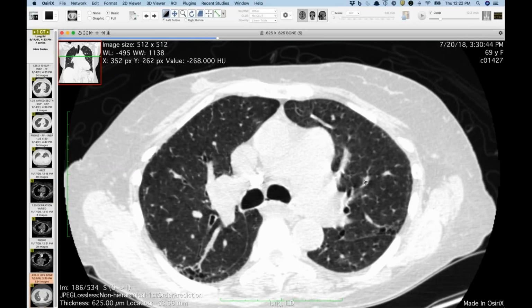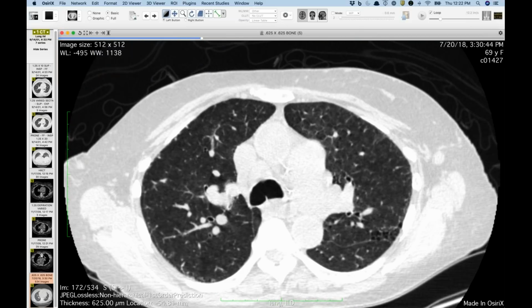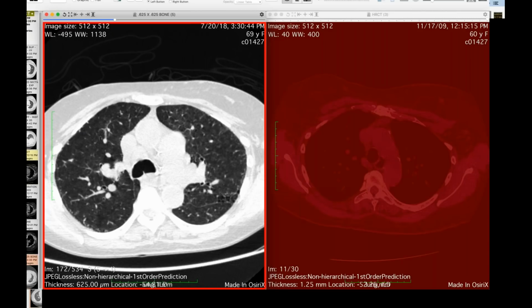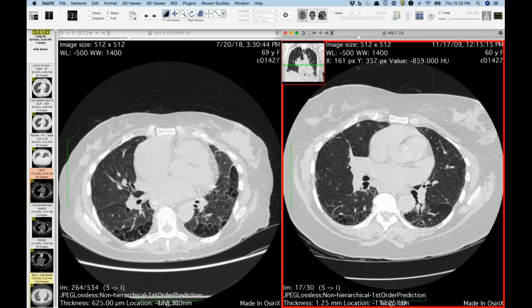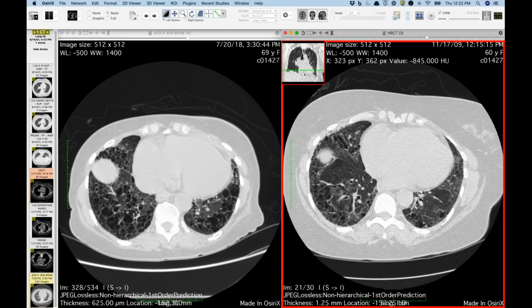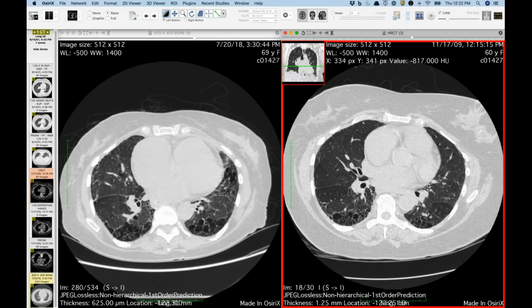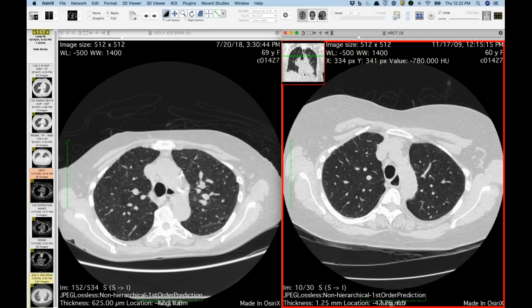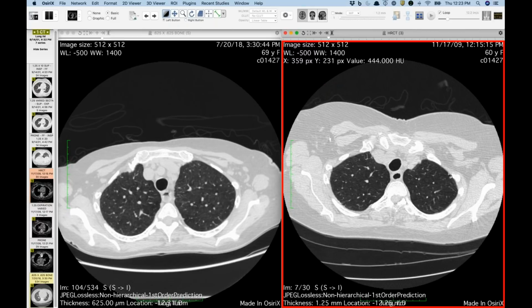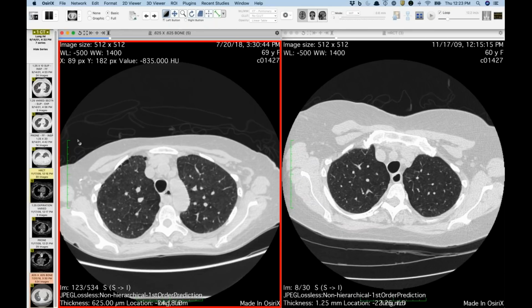This is a pattern that we've seen numerous times in connective tissue disease patients, and this patient had a history of mixed connective tissue disease. This is a nice one because I have almost 20 years of temporal evolution of these findings. They haven't been on treatment since 2009, and in 2009 there's a pretty similar appearance, maybe a little bit of evolution and increase in severity, but that would be unusual for UIP, IPF. Also, there's just not a lot of reticulation in the remainder of the lungs; it's more like normal lung with just an interface with cysts.